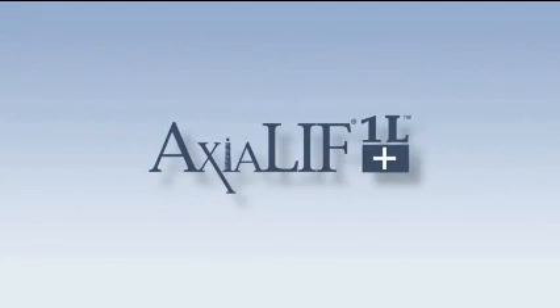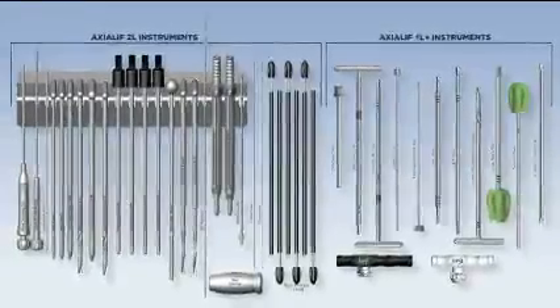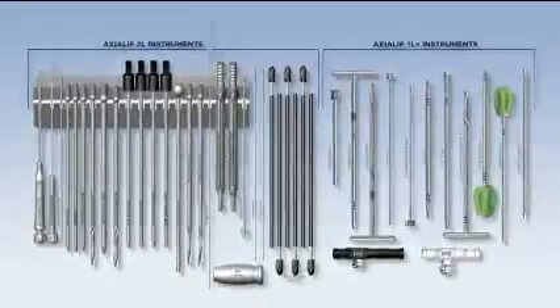Axialif 1L Plus. The operating room setup fits conveniently on a Mayo stand and follows the procedure sequentially from left to right.